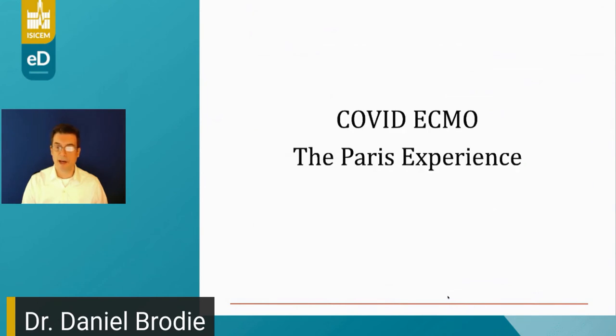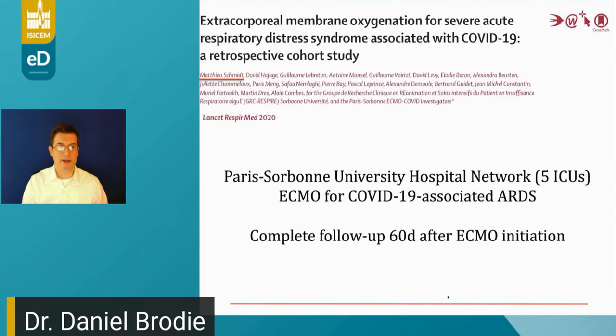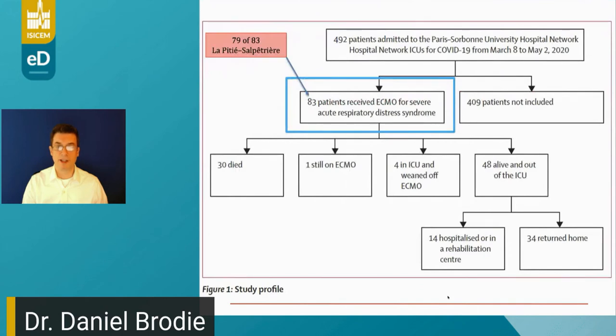Well, there are a few very nice papers out now. I'll show you three of them. This is the experience from Paris, written up by Matthieu Schmidt and colleagues for 5 ICUs in the Paris-Sorbonne University network. They had a 60-day follow-up after ECMO initiation. This is 83 patients, notably 79 of them were from the hospital of La Pitié-Salpêtrière, which is the hospital of Matthieu Schmidt and Alain Combes.